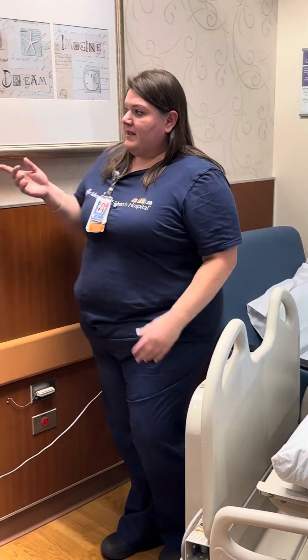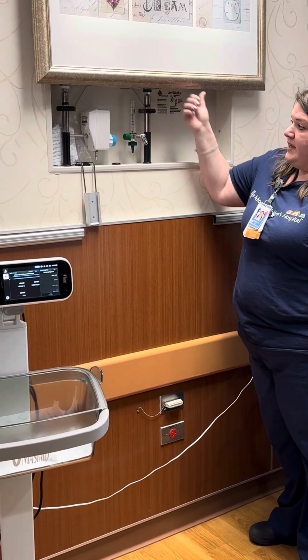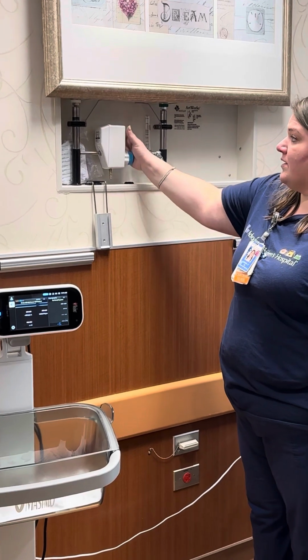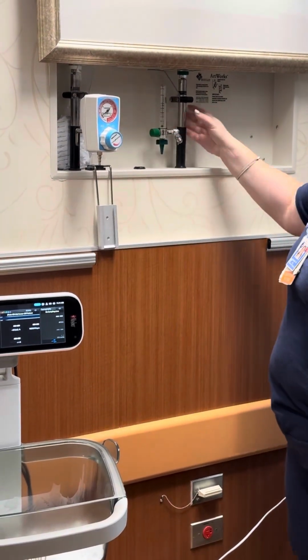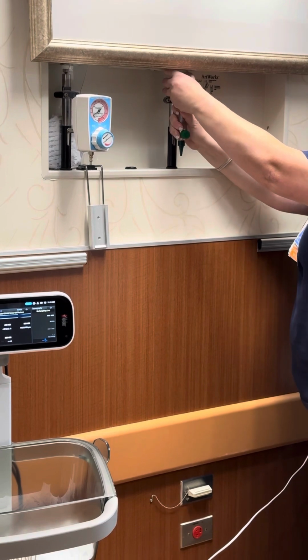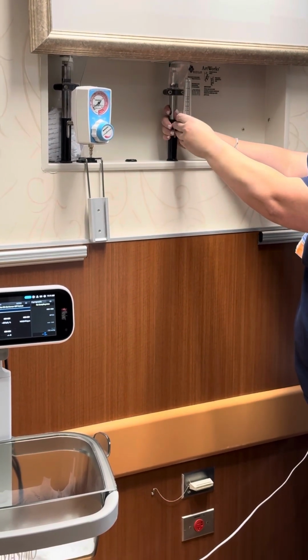So at the head of the bed, all the patients have this picture. We're gonna push the picture all the way up, and you'll see underneath that you have your oxygen and your suction. What you need to do to make them work is turn them out and you'll feel it click. That means that you're in the right position, that you will get airflow through them. You may have to work with it a little bit just to get it to the right spot.